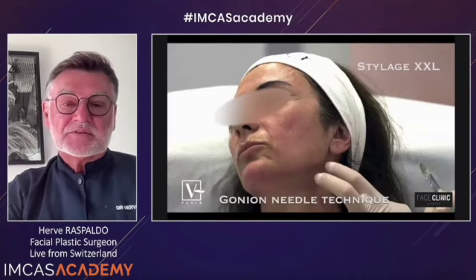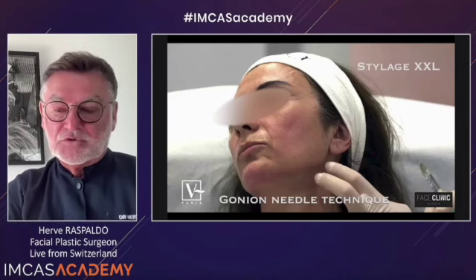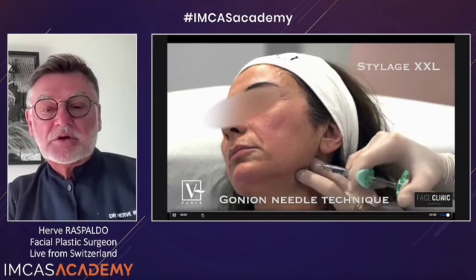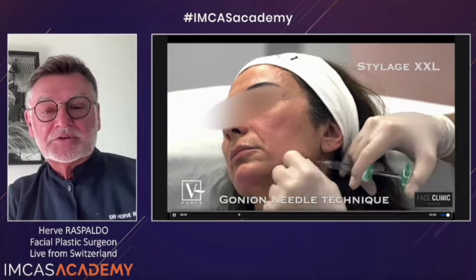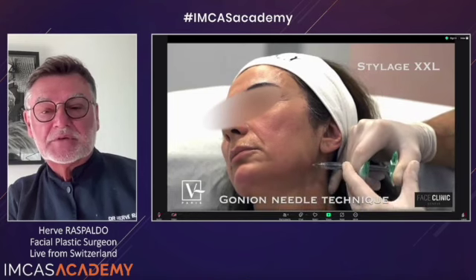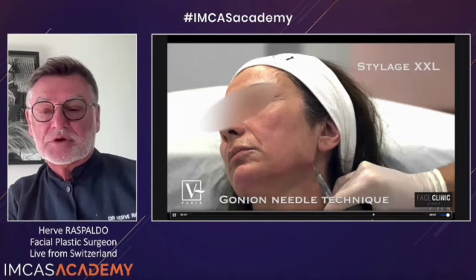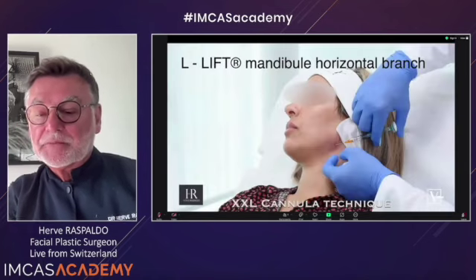So the technique, every single video I show you here is available on the Vivacy e-learn platform. So I just give you some short parts. So you have to fill the bone, and when you fill the bone, then you start to inject on contact with the bone. You create a bolus or a pyramid. Then when you get this pyramid projection, you can go a little bit higher under the skin, not deep, because otherwise you are on the parotid. And then you can start to do a little bit of your horizontal branch. And you see the projection laterally, but also medially.